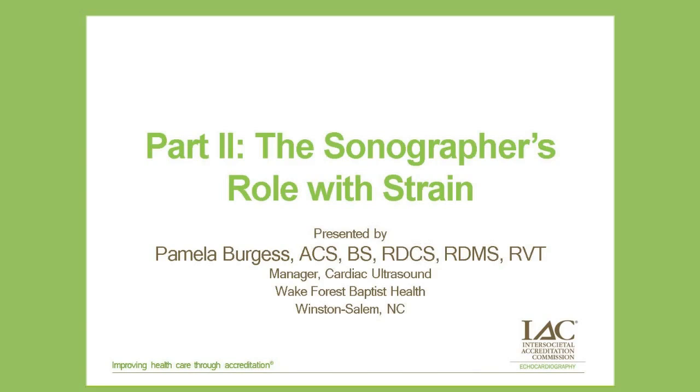Thank you, Dr. Plana. My role in the webinar today is going to be more the sonographer's role with strain, which is an extremely important role. Much like anything we do in ultrasound, strain is very technically dependent. So it requires good technical skills with optimizing the 2D image in order to provide accurate and reproducible strain results. Just remember, any error in our strain can directly affect our patients.